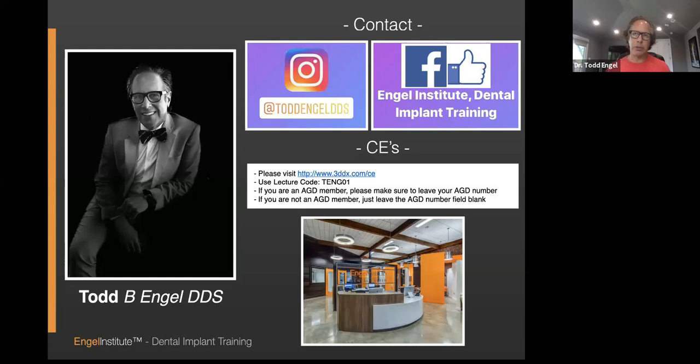And what you're going to do is decontaminate. It's important you understand that. You can't sterilize anything in a patient's mouth. You can decontaminate it, okay? So we are decontaminating it. We are essentially opening up some new cellular activity. We are going to irrigate a lot. I want you to irrigate about 2 or 3 monojets full. And the reason I want you to do that is because this can burn, okay? Because it's very acidic. Then you're going to graft.